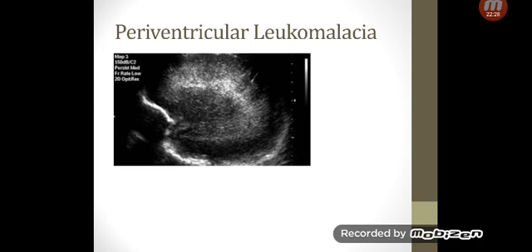So what is that? Now we're going all the way to the far away view, the sagittal view, either right or left. When you go to S3, right or left, that should be showing your parieto-temporal lobes, right? What you can appreciate here is a flare. It seems really exaggerated, right? This is a flare where it shouldn't be, and it's also exaggerated.